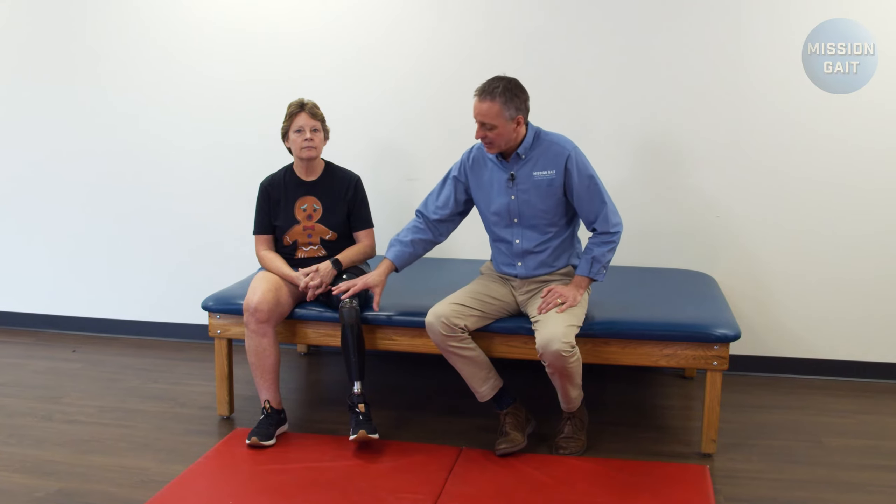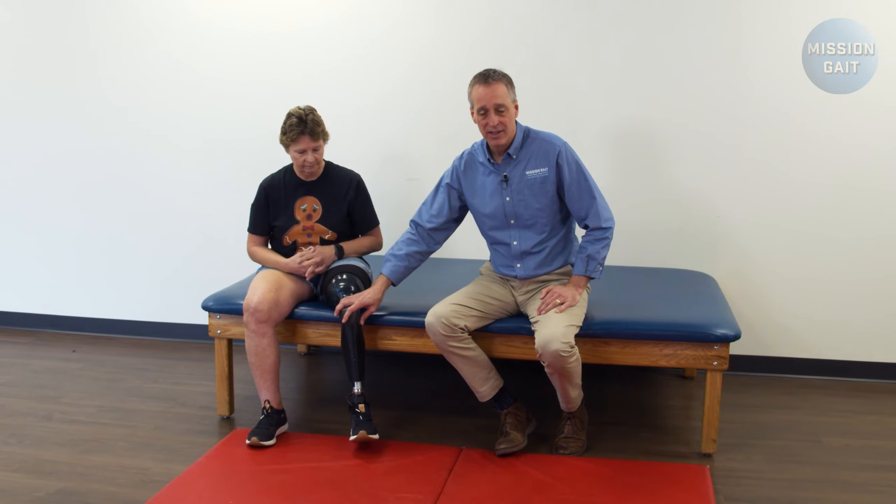When we're working on transferring with a unilateral prosthetic device, the first thing you want to work on is getting on the floor safely so the patient can get down and get around if they need to, but also if they need to simply practice transferring from the floor, they need to get down there safely.